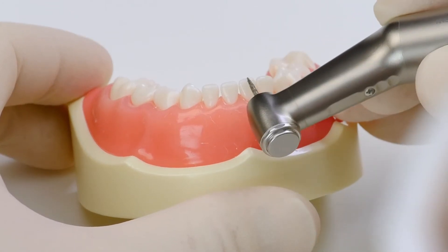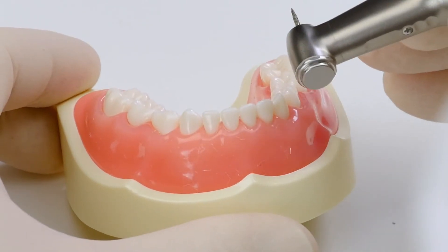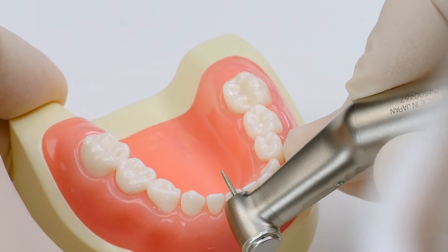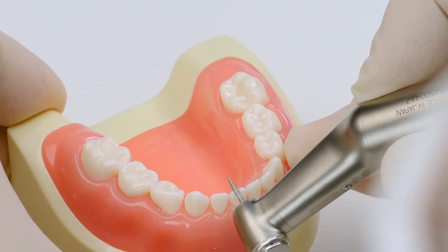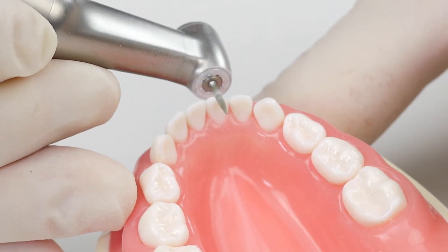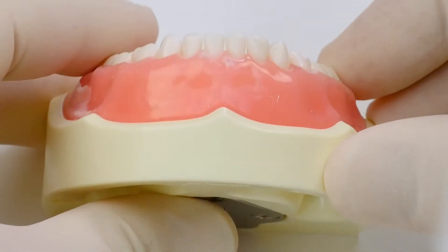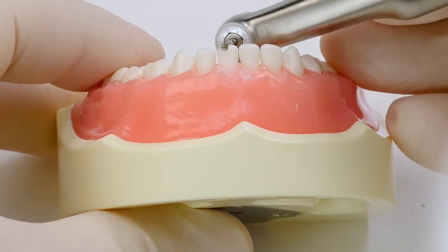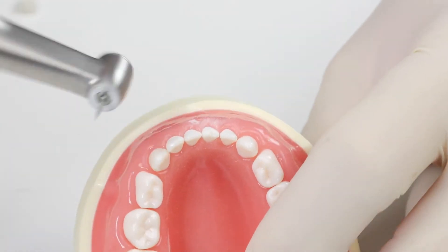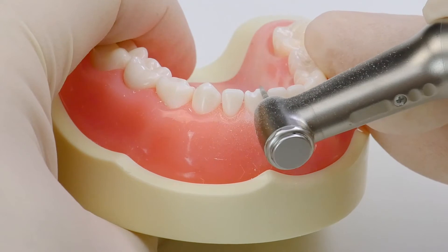For your incisal reduction, I make a depth cut the thickness of the widest portion of this burr. I'm going to go ahead and prep down so I can show you on this video. You can kind of see my reduction here — basically it's the width of the widest part of this diamond right here. Once you have that little depth cut, then all you need to do is just smooth it off so that it's even.